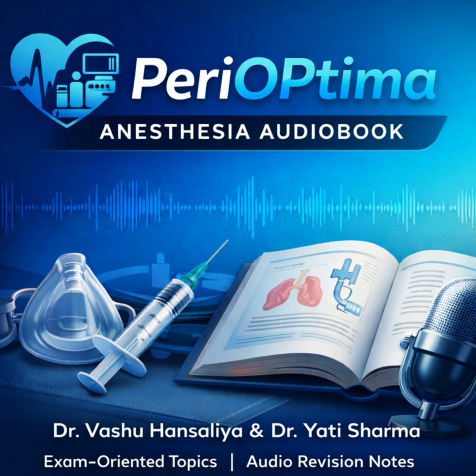What about afterload? In VA ECMO, high afterload is a big problem. Remember, the patient's own LV is trying to pump against the retrograde flow from the ECMO machine. So you're creating a fight. Exactly. You want to maintain a mean arterial pressure of 60 to 80 millimeters of mercury. Too high, and the LV can't open the aortic valve at all. That leads to stasis and thrombosis in the aortic root.